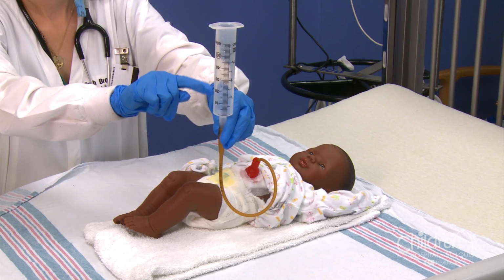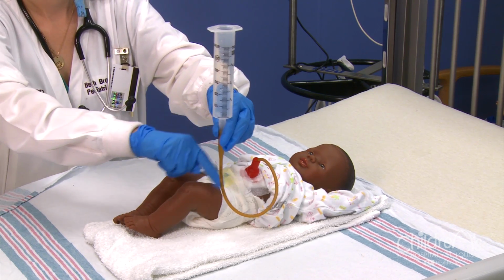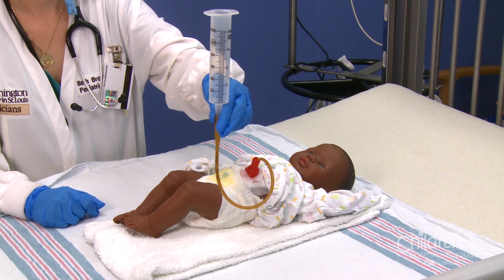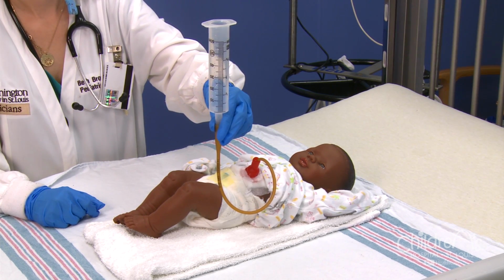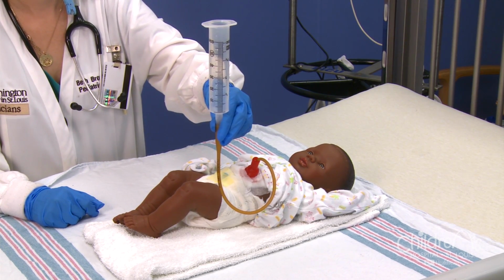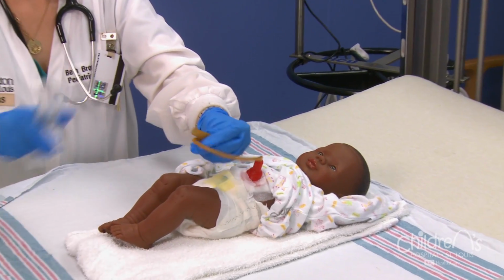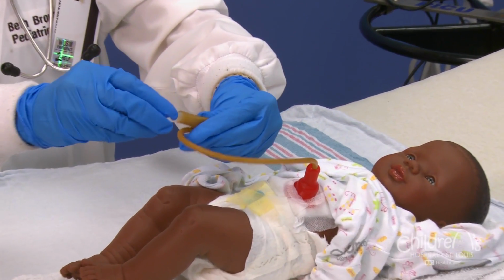It is not uncommon to see formula or stomach juice rise into the syringe. Once the gas is relieved, allow the formula or stomach juices to slowly flow back into your child. Clamp the tube and replace the cap or rubber band to close the gastrostomy appliance.